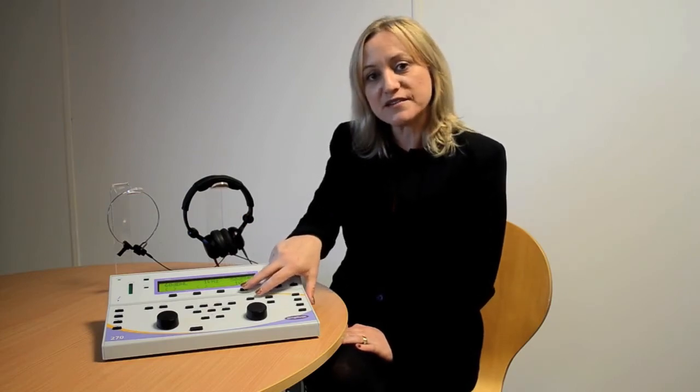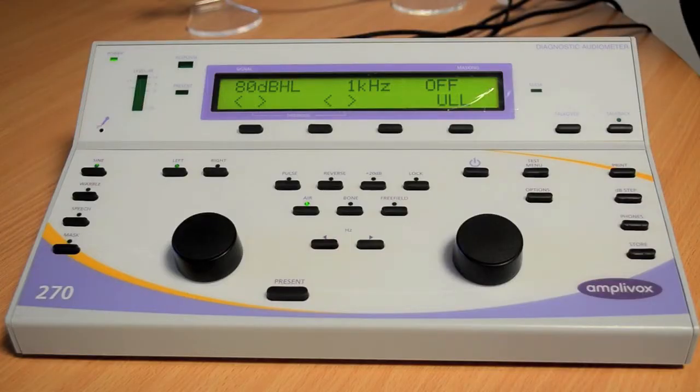You'll notice on the screen that it says THL, threshold hearing level. You can change this by pressing the fourth soft key to ULL, uncomfortable loudness level.